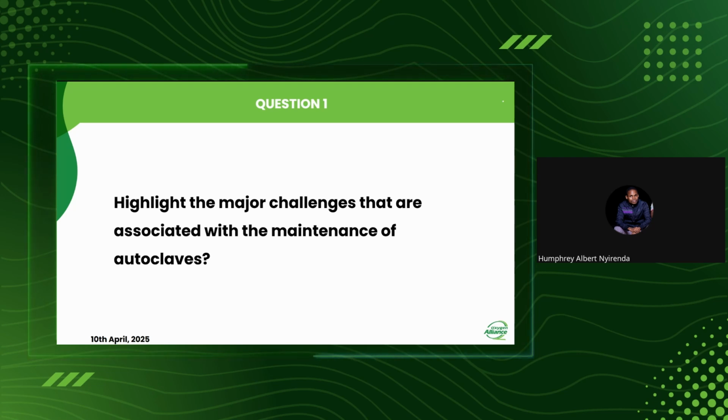So these are the main major causes of element issues. In Malawi, we have places like Kalonga, where we have salty water, and also other places where they have salty water. So the hardness of the water is the main cause of element issues in such areas. And to mitigate that, we have to treat the water.